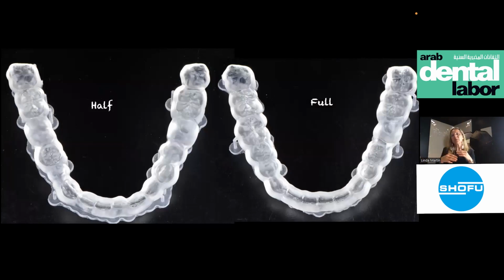Because when you want to push all the composite at one time, you will have the teeth stick between them. But we don't need that. We want prevention. We want to clean our teeth and to take one. What is it? Pile dentaire. Don't have the term. Dental floss. We need to push dental floss between the teeth. So it's not possible to stick the teeth together.